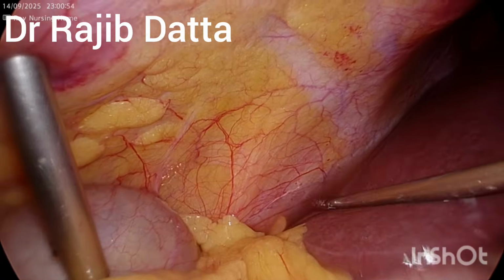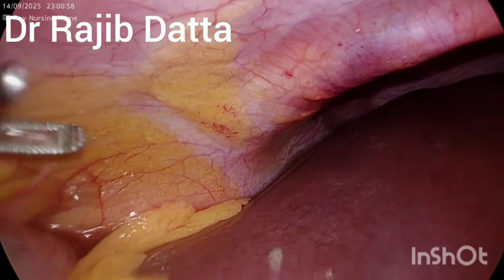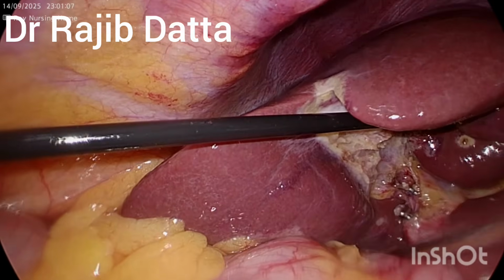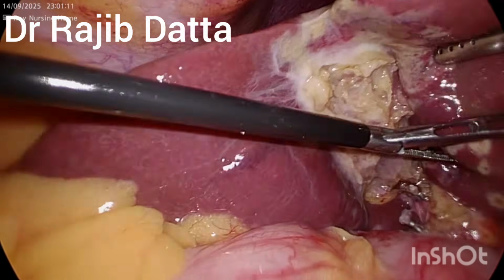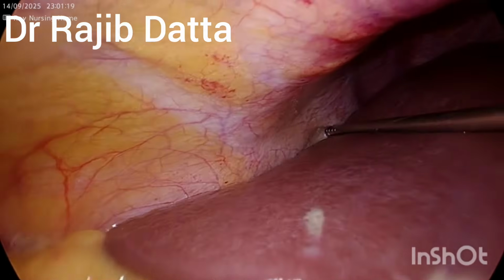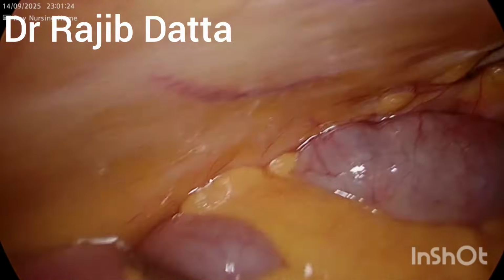Thorough irrigation with warm saline and suctioning is carried out simultaneously, and the entire field is bloodless, no bleeding from the liver bed or from the clip sites, and no leakage is there.